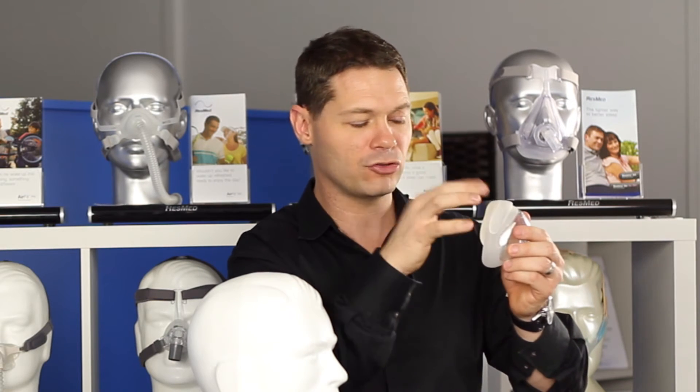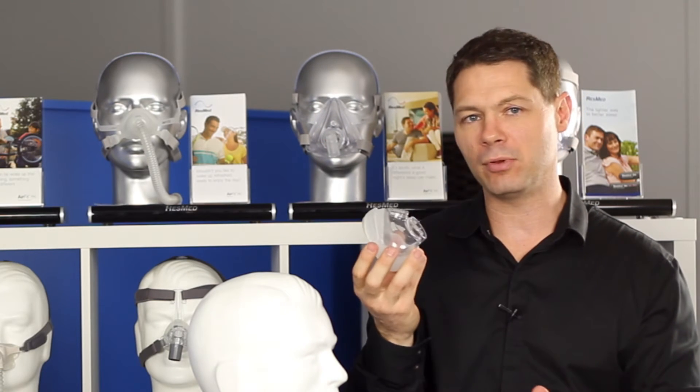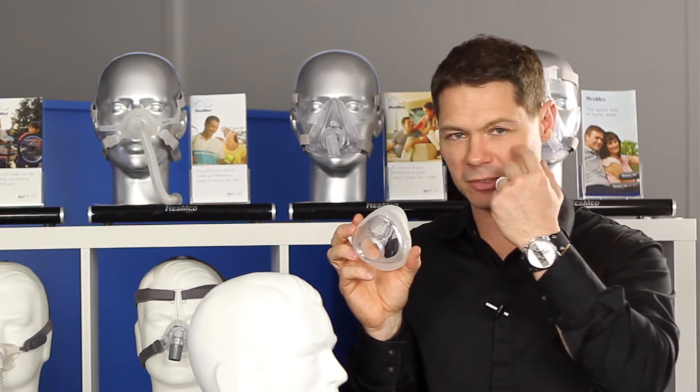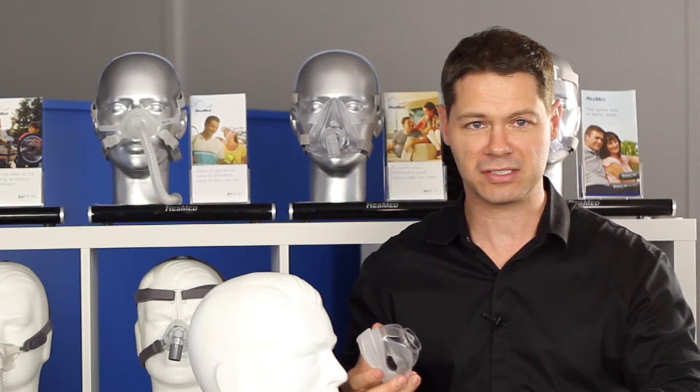It's important to get the size right. We want to have the bottom seal sitting just underneath the lip, and the top bit sitting right on the bridge of the nose. We find that Simplus masks are great for people especially that have a slightly broader nose. People that have really thin noses at the top can experience a little bit of leaking in the eyes, but at the end of the day, all full-face masks leak anyway.